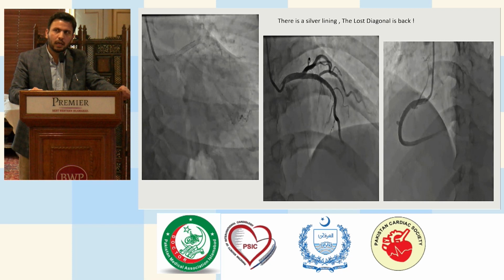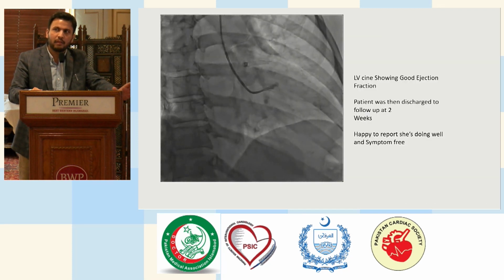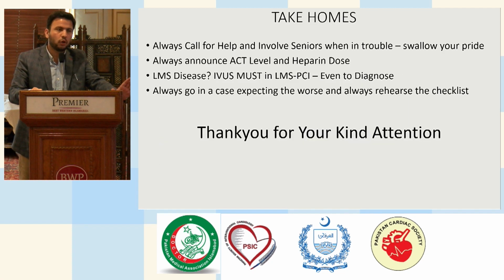That diagonal has come back. That's a good sign. And her LV cine shows that her EF is preserved. She's running a good LV. So the take-homes from this scenario are these.